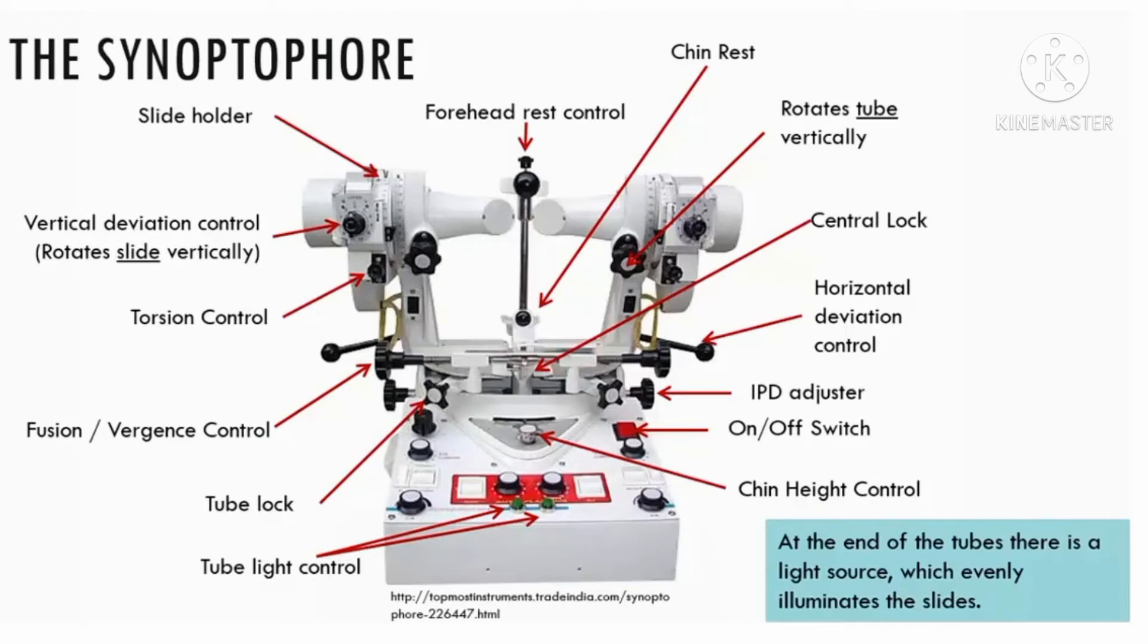Next is slide ejector. By pressing the slide ejector, we can remove slides from the slide holder and we can easily put in the next slides.